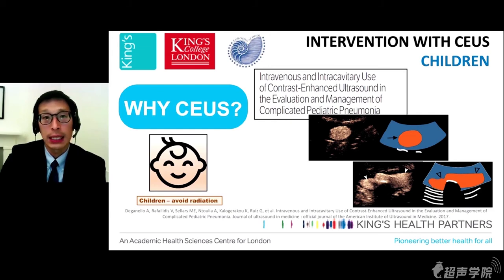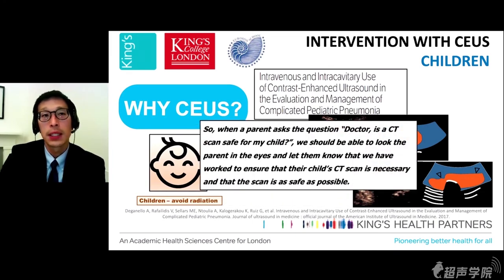I think this is just an example where contrast enhanced ultrasound can provide a unique solution in the pediatric population. And this is important not only for medical reasons, but because when we as doctors face parents asking us the question, doctor, is a CT scan safe for our child?